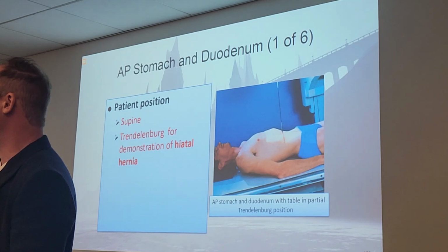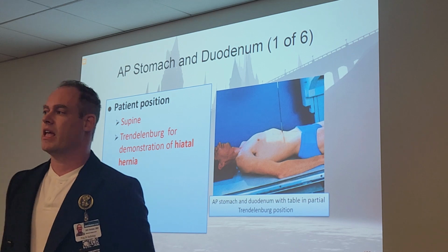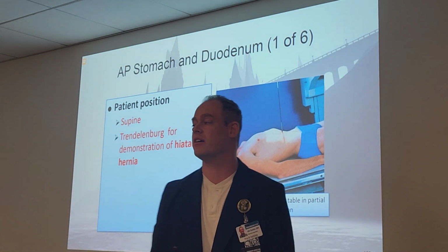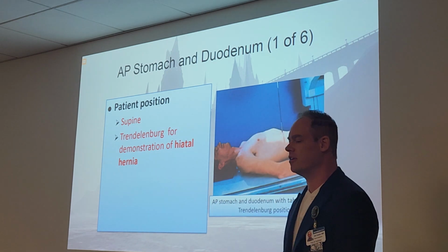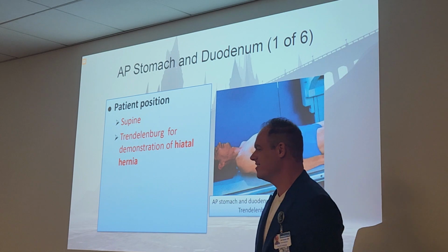And finally, the AP stomach and duodenum is going to be supine. Special notes: if the patient has a suspicion of a hiatal hernia, instead of a regular supine, we'll do Trendelenburg. Remember that? We didn't talk about that since first semester. Head down, head lower than the feet.